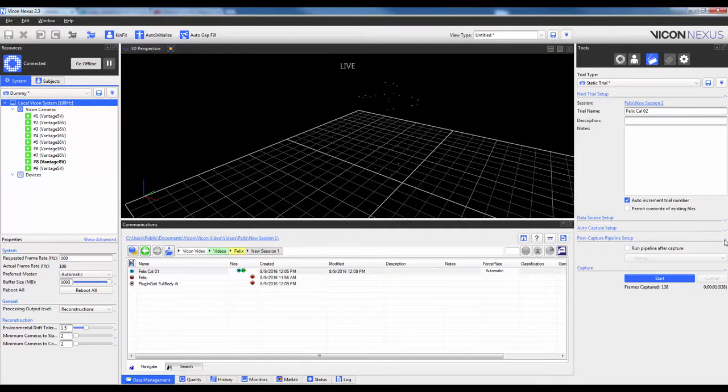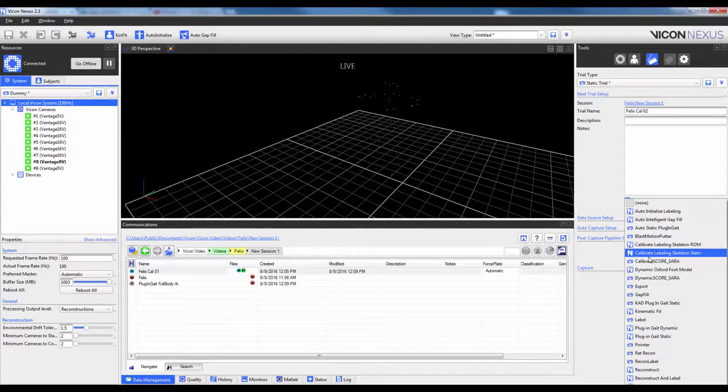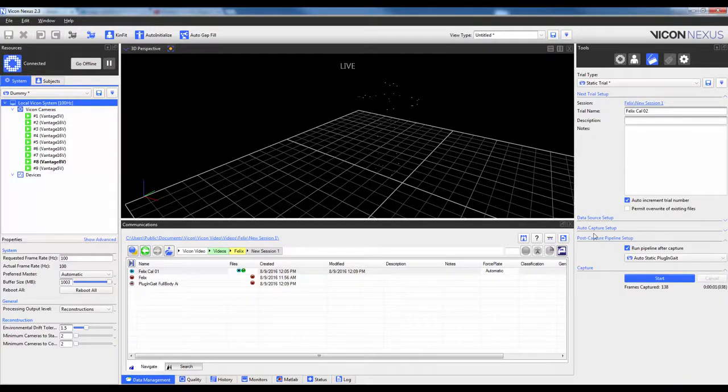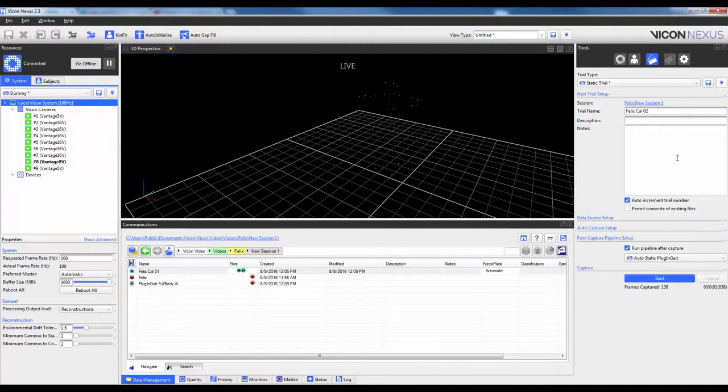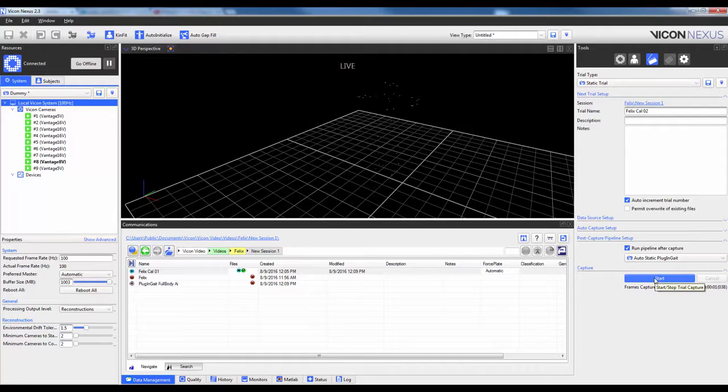And then under my Post Capture Pipeline Setup, I'm going to make sure to run a pipeline this time, and I'm going to go ahead and select the one that I just created, which is Auto Static Plug-in-Gait. So now when I click Start, it should automatically run through and do everything for me. So, I'm going to go ahead and save this trial type first so that it runs this every single time, and I'm going to go ahead and click Start.